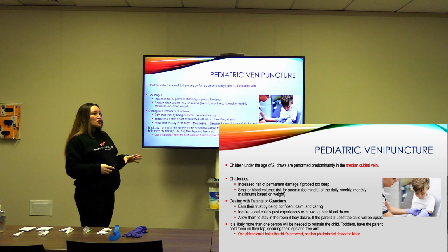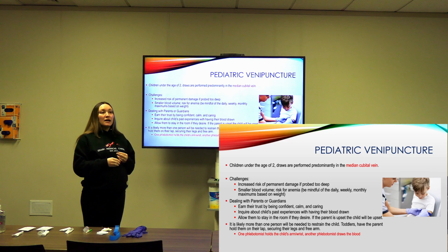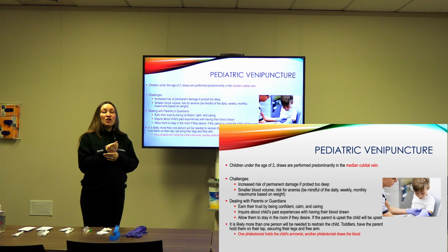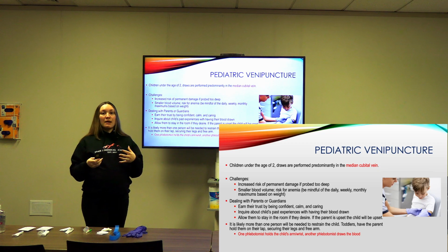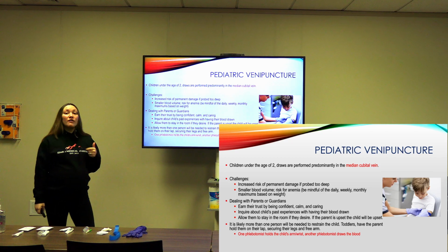With pediatric venipuncture comes parents, okay, because parents generally stay in the hospital with the littles. So that means the parents will have the ID band. You're coming in and you're introducing yourself to the parents. You're establishing rapport with the parents, okay? Earn their trust by being confident, calm, and caring.